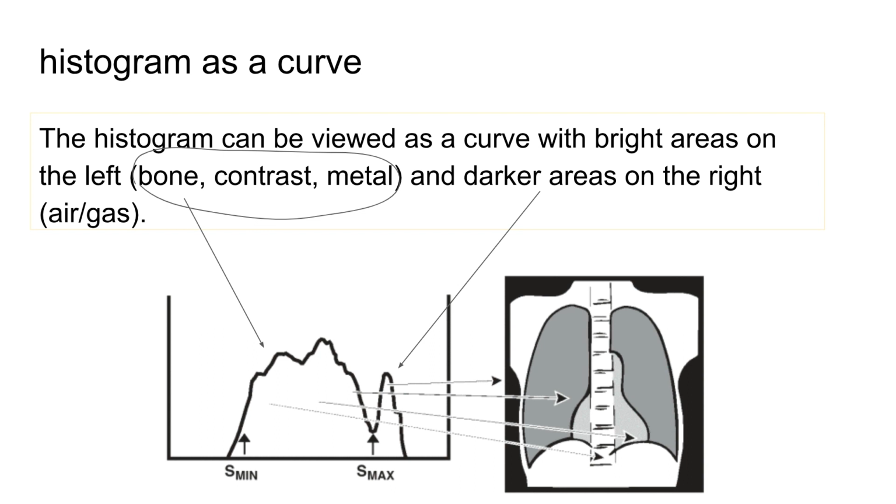And the system knows to take that information. The hardest thing is knowing that that is there, right? If it doesn't pick up on that, then you have a problem. But the system is designed to pick up on an area of raw radiation, create this spike, then remove it from the actual processing. We'll talk a little bit more about this in a second.